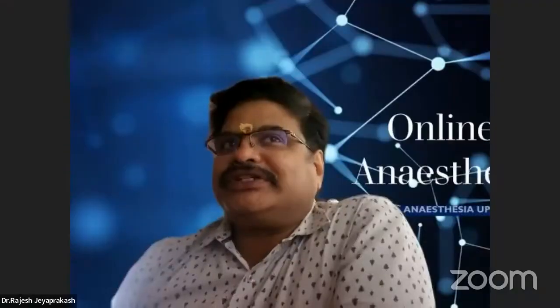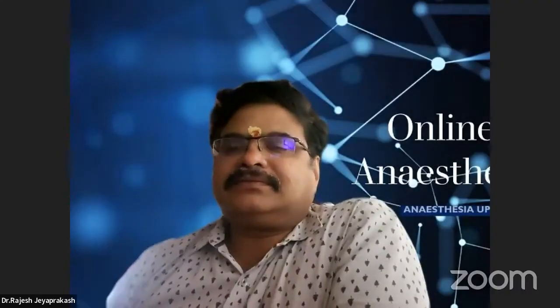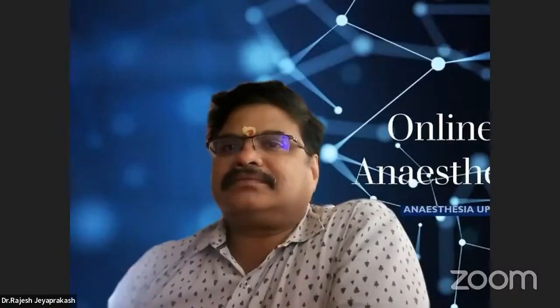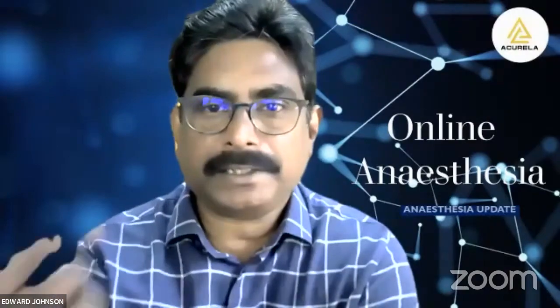Is there any role for bougie in video laryngoscopic intubation, sir? With a hyperangulated blade, an angulated blade, there is no role for bougie, because the bougie is malleable and it cannot take the shape of the oropharynx or the shape of the laryngoscopic blade. You find more difficulty. The CMAC, they have supplied a J-shaped stilet. Yes, many companies are now supplying a J-shaped stilet.